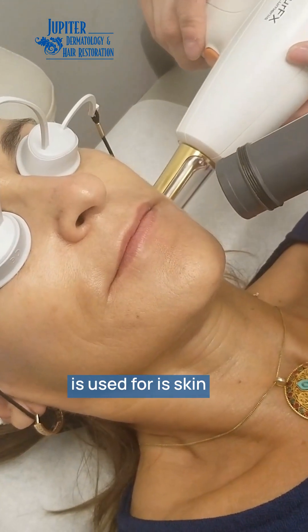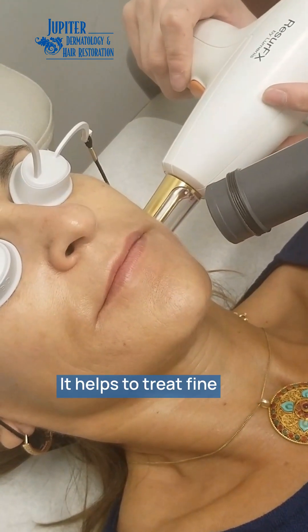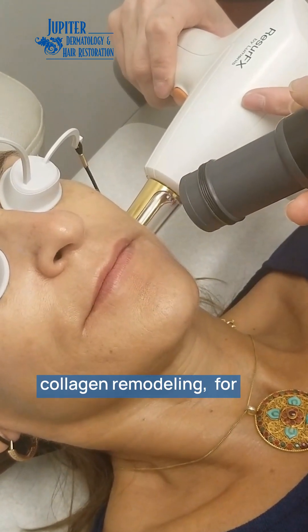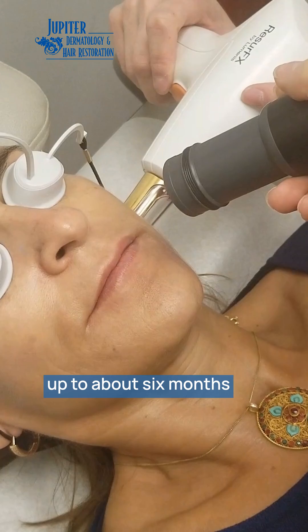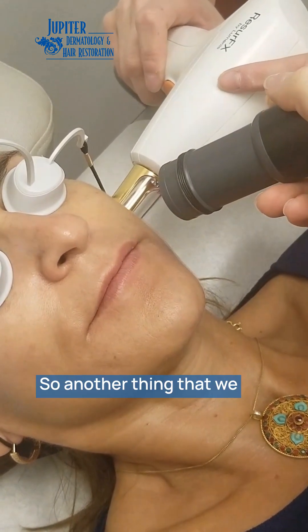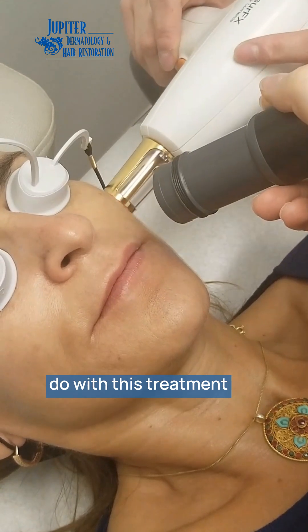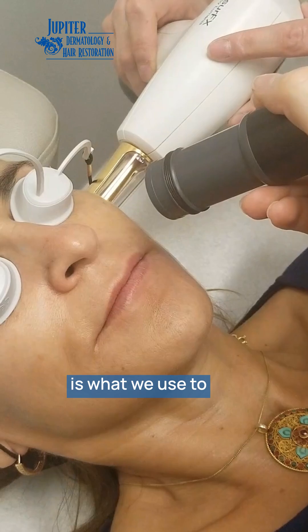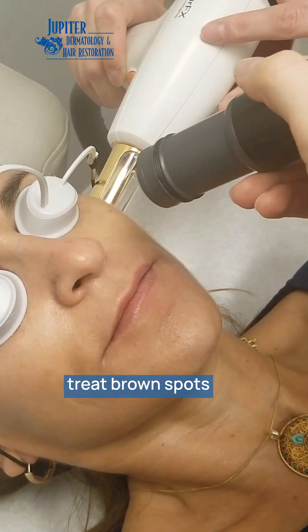The Resurfix is used for skin rejuvenation — it helps to treat fine lines and wrinkles and stimulates collagen remodeling for up to about six months after the treatment. We also pair it with our IPL treatment, which is what we use to treat brown spots and pigmentation.